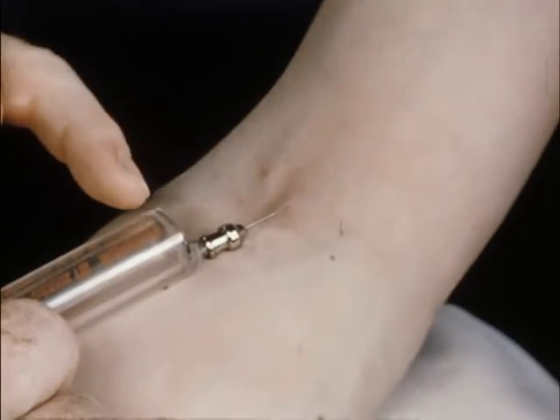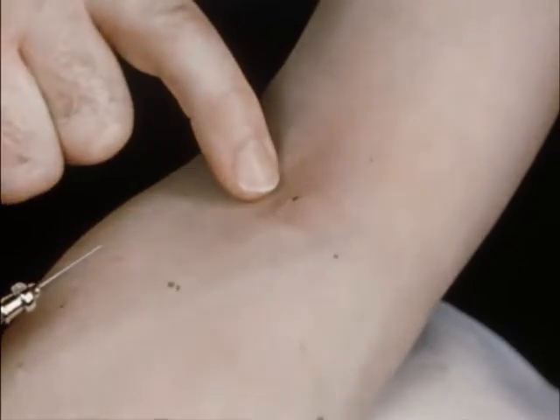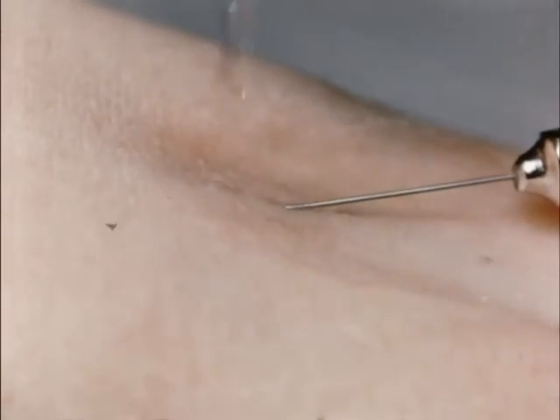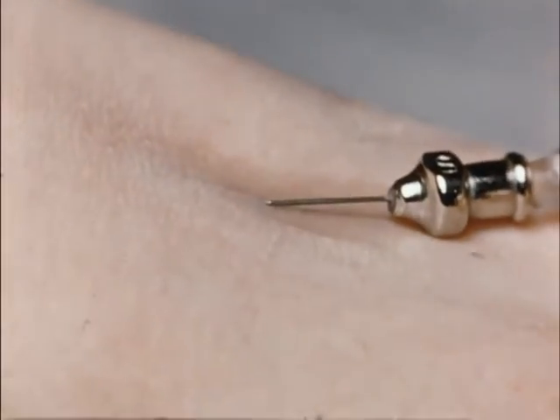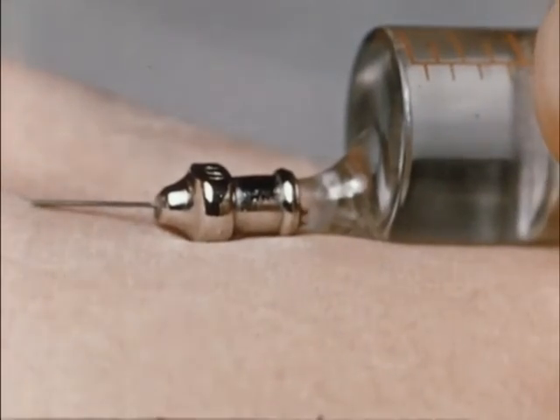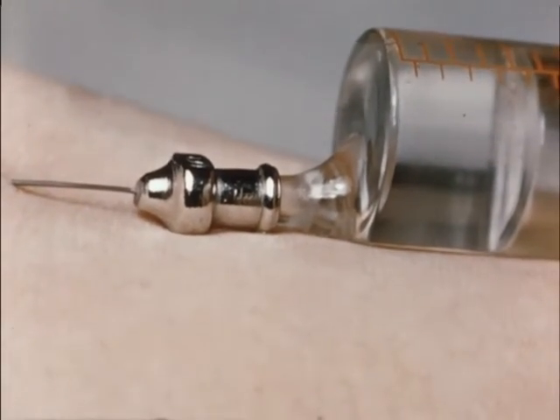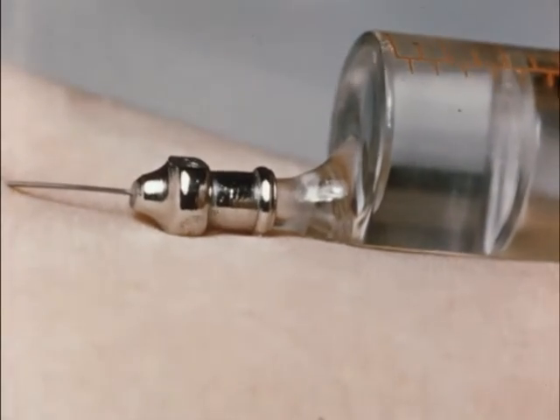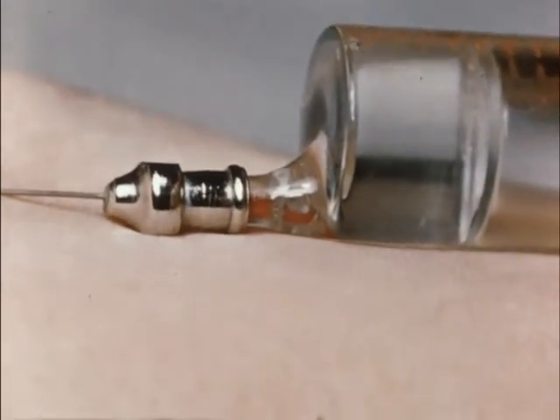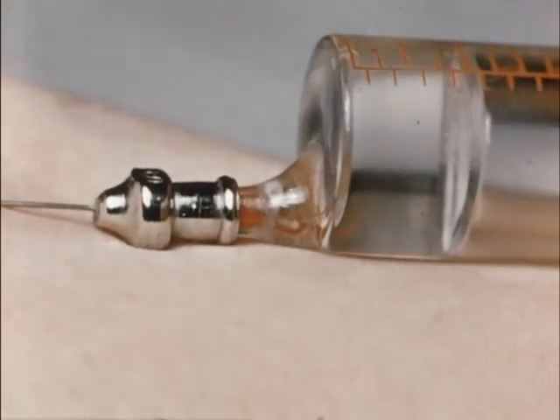For a tiny vein, a short bevel needle will be used. There is little bleeding from the puncture, but pressure should be applied for a few seconds immediately after withdrawal to avoid any haematoma from leakage. Here is shown the sequence in close-up. After the puncture, the arm grip is removed. Though the needle point be quite still, this may cause movement of the tissues and the vein — therefore, a second check is made at once before starting to inject. This simple withdrawal test can help to eliminate all local complications associated with venipuncture. But personal responsibility and care are the main keys to success — with a special rule: if you are not certain, you do not inject.